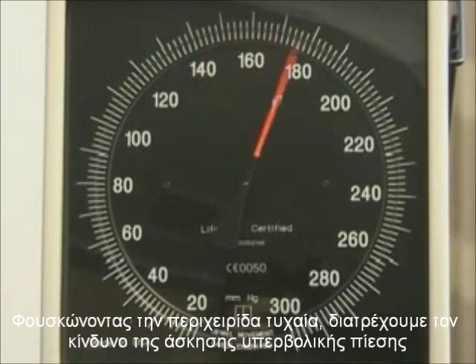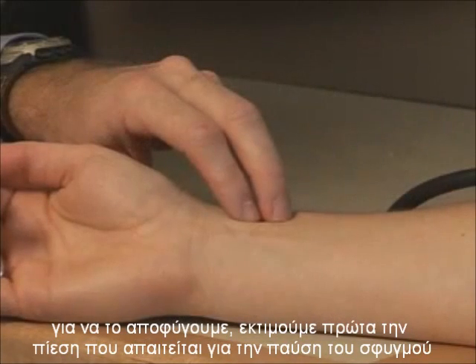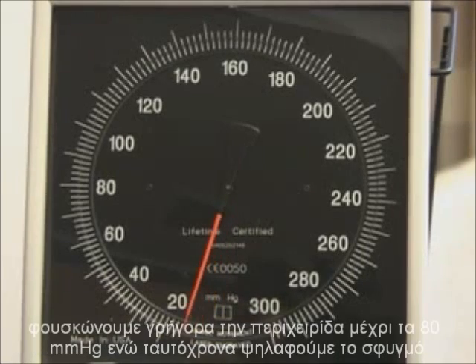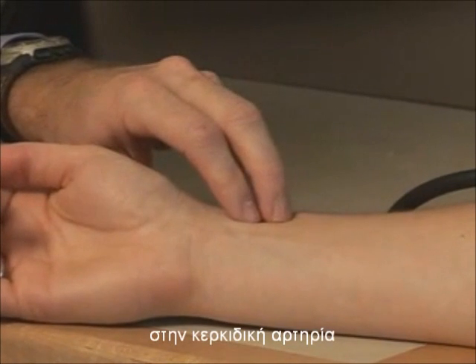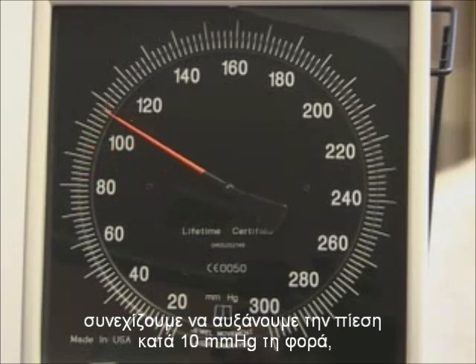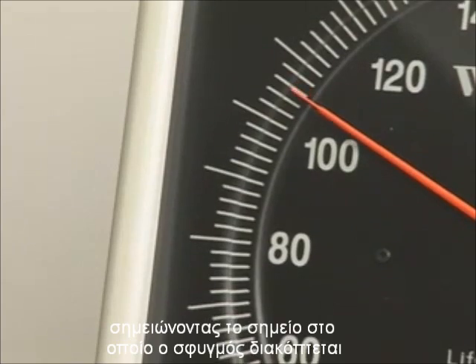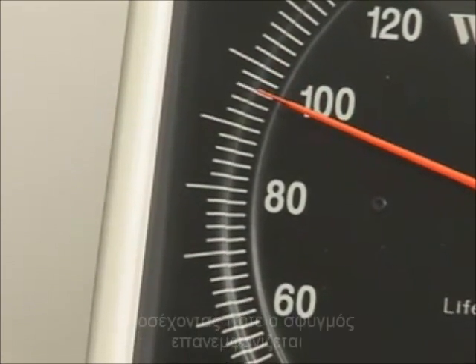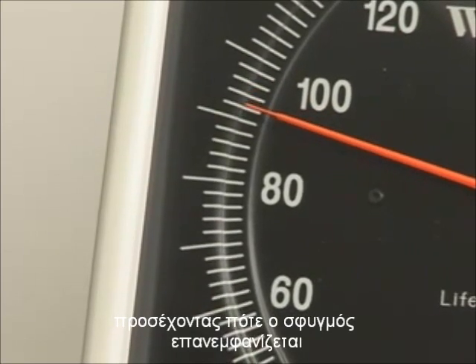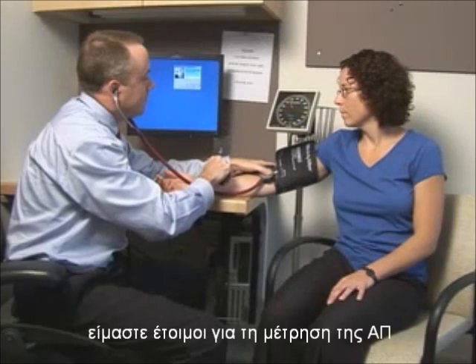Inflating the cuff to some arbitrary level runs the risk of excessive overinflation. To avoid this, determine the measurement of the pulse obliteration pressure. Rapidly inflate the cuff to 80 millimeters of mercury while palpating the radial artery pulse. Continue to inflate in 10 millimeters of mercury increments, taking note of the reading at which the pulse disappears. Then, deflate the cuff at a rate of 2 millimeters of mercury per second, noting when the pulse reappears. Once the pulse obliteration pressure is determined, you are ready to measure the blood pressure.